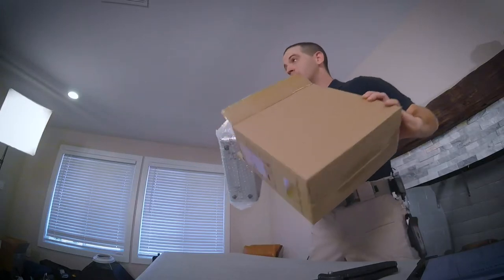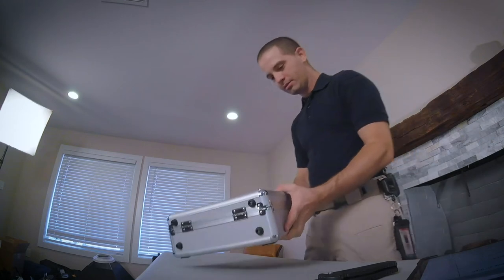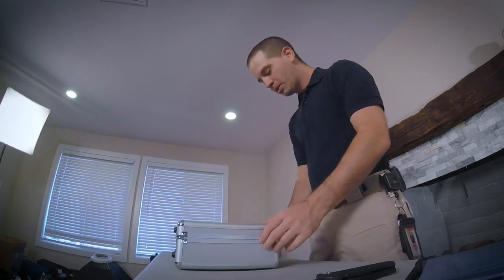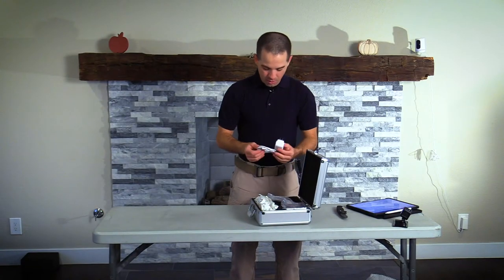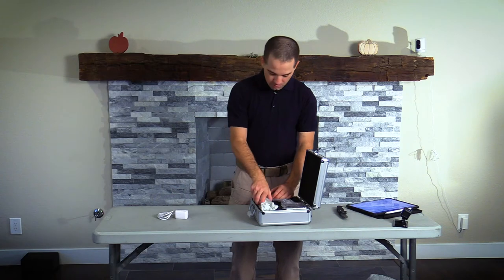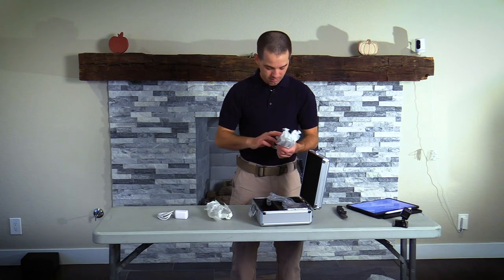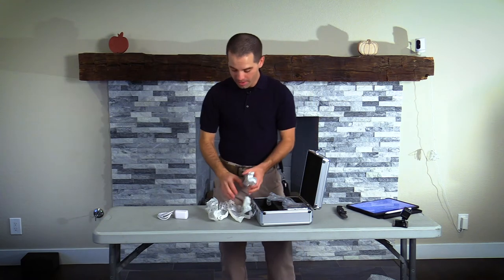The Clearview Video Laryngoscope comes inside a cool metal case — the Infinem Clearview Video Laryngoscope. Opening up the box, we've got a USB charger that charges via USB. We've got different sized blades: a MAC-2, a MAC-1, a MAC-3, a MAC-4, and a MAC-5 blade.